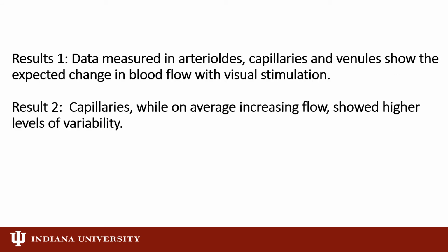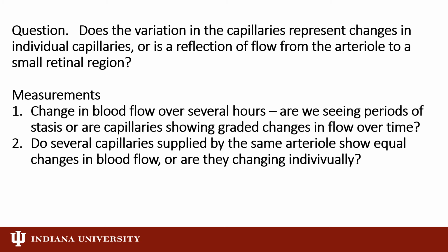And so at this point, we've got a result that the data measured in arterioles, capillaries, and venules show the expected change in blood flow, but capillaries showed high levels of variability. And so that's what we want to address in the remainder of this talk. We want to look at these capillaries and see what they do when you just don't change the stimulus, just leave them steady for like 4.5 hours. How does blood flow change?